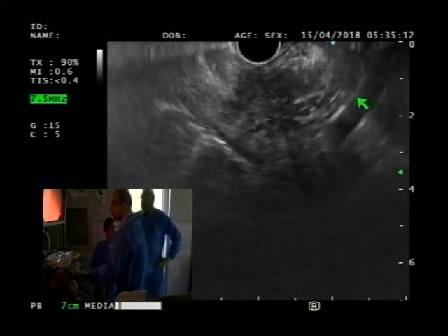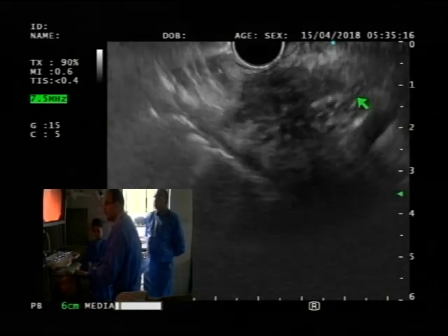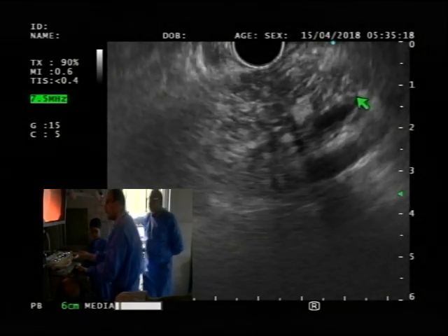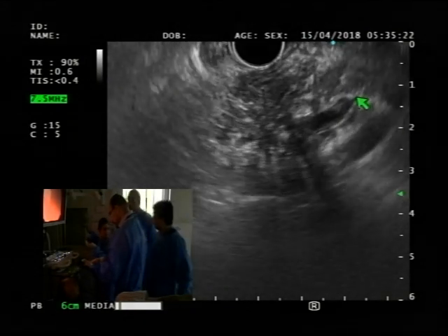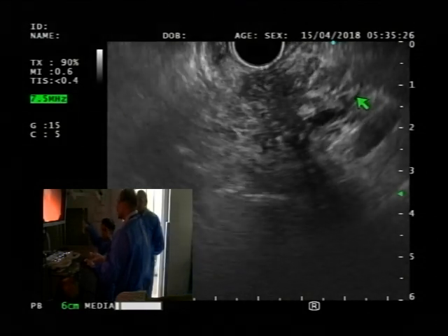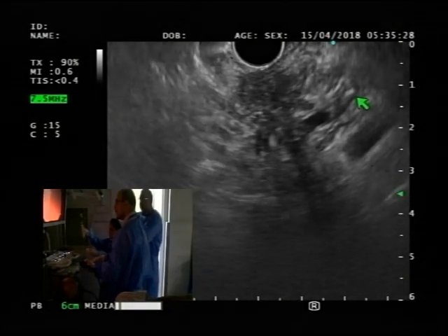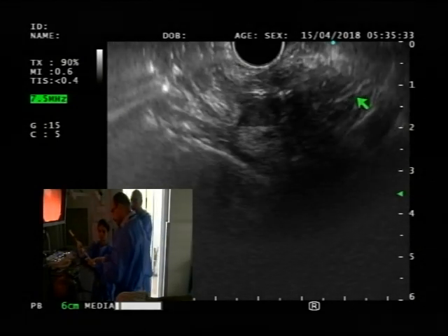I think you need to get, sure. The things you can change are to have less suction because it's getting very bloody, or zero suction, and do a stylet pull only, or even without the suction, just do FNA, which we may do. This time we'll keep suction on, we'll do it without that.